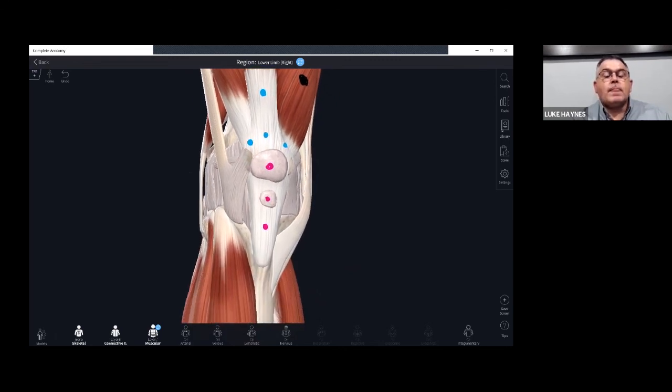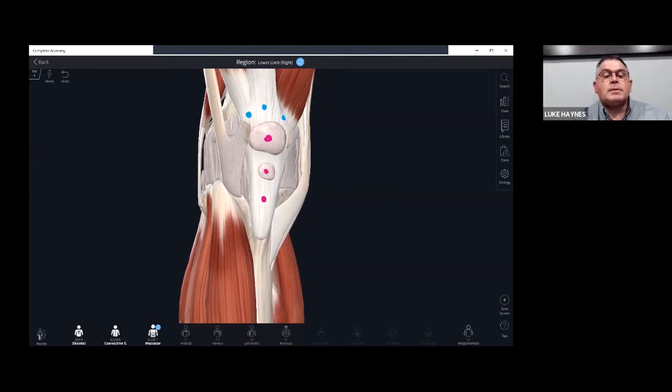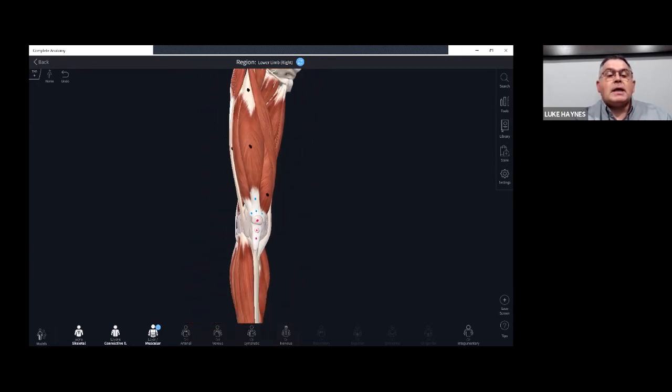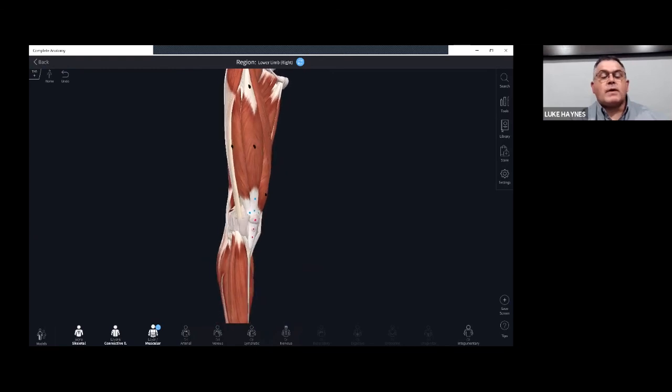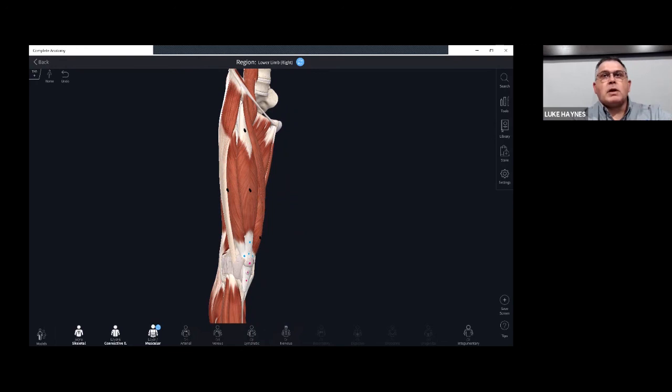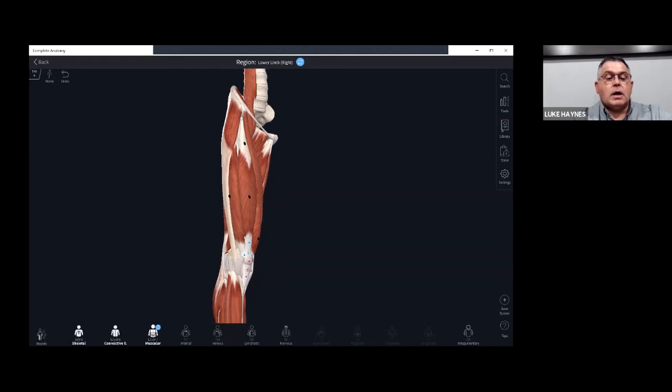Then we want to needle the suprapatellar and infrapatellar bursa. And then lastly, we want to needle into the patellar tendon or the patellar ligament itself. Again, for me, key here, needling is great to improve pain and inflammation. It tends to be associated just as frequently with a lack of terminal extension if it's not an overuse issue. So when you're treating that, make sure that you take a look at terminal extension. If not that, then let's go supine or prone and look at full quad length. Odds are we're going to see a length issue.